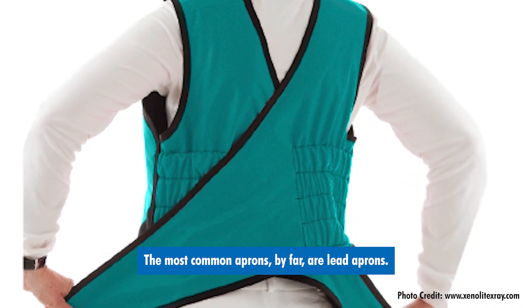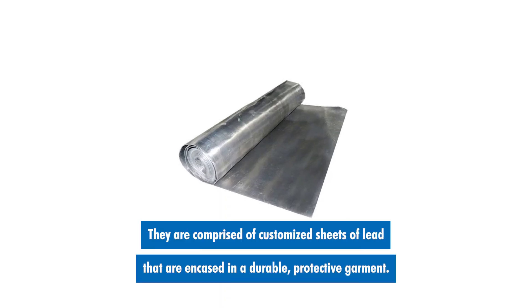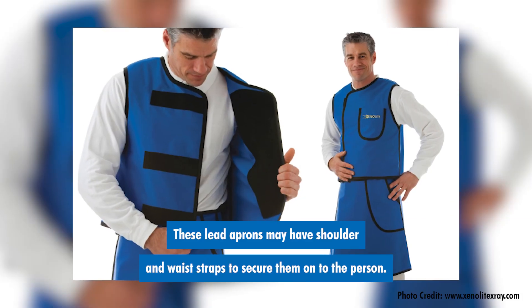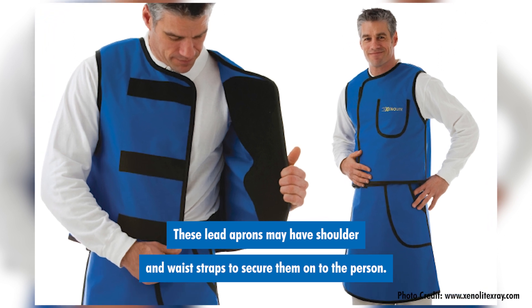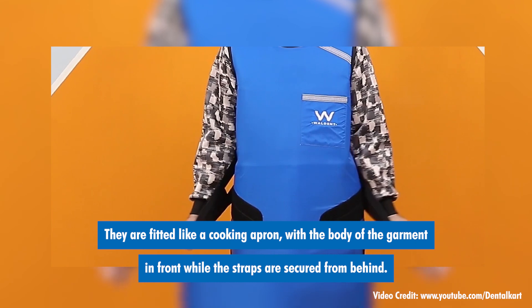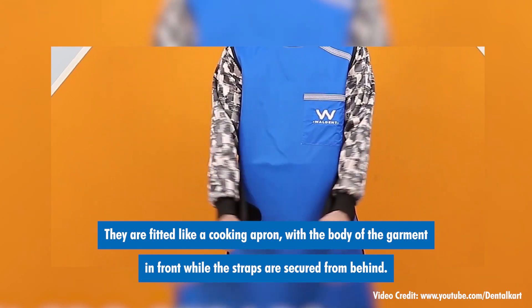The most common aprons by far are lead aprons. They are comprised of customized sheets of lead that are encased in a durable, protective garment. These lead aprons may have shoulder and waist straps to secure them onto the person. They are fitted like a cooking apron with the body of the garment in the front while the straps are secured from behind.